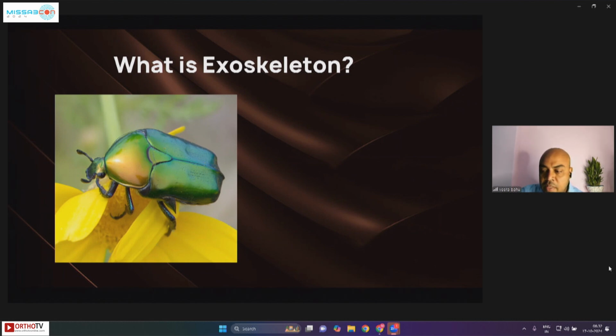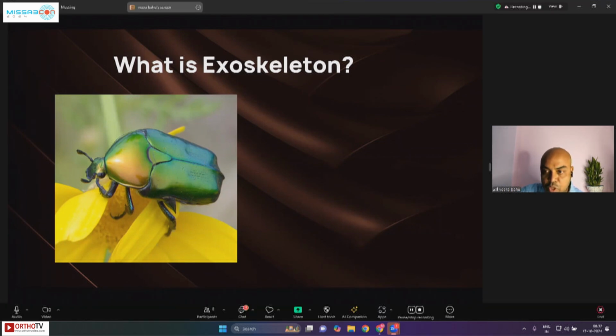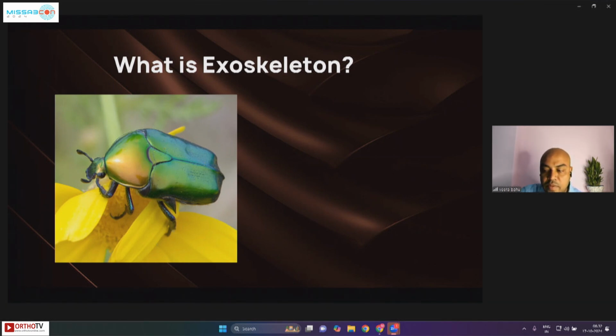So in this context, specific to spinal cord injury, we have a human who has zero power in his lower limbs. And also, there is an endoskeleton, which means that it's a skeleton within the system, and then you have an exoskeleton covering this soft tissue. So there are two different considerations. One is giving power to the system, to the joint, and giving structural integrity to these systems.